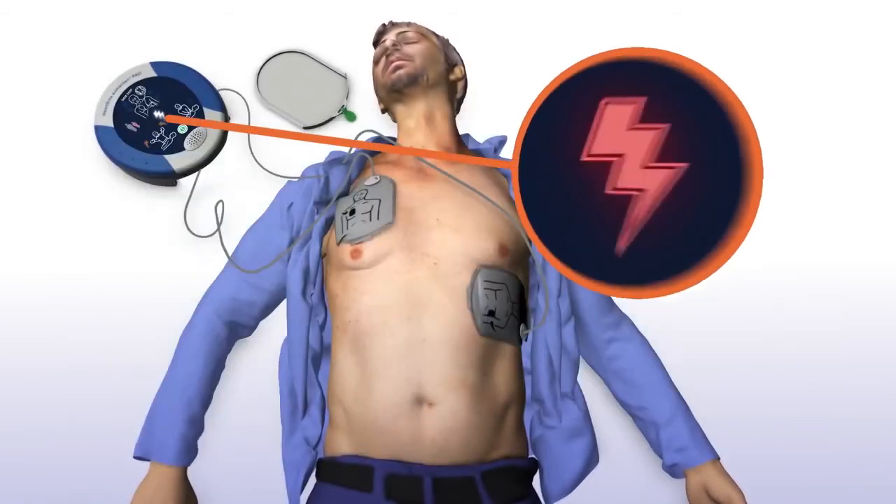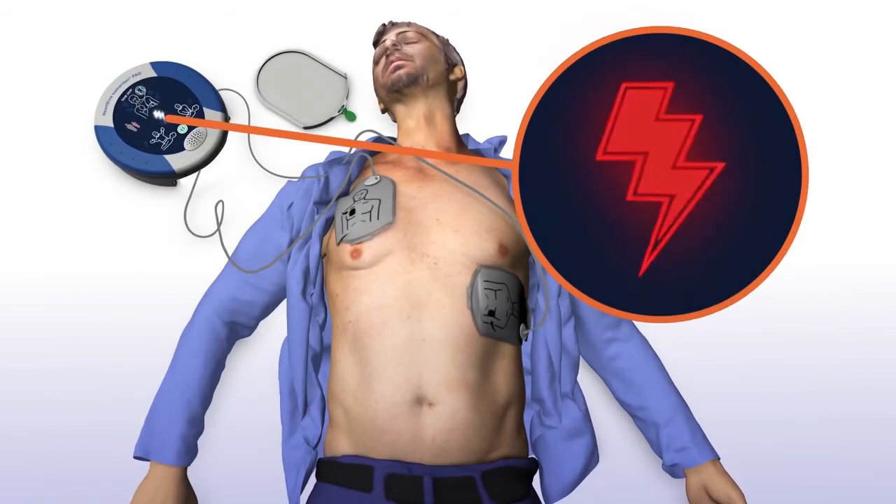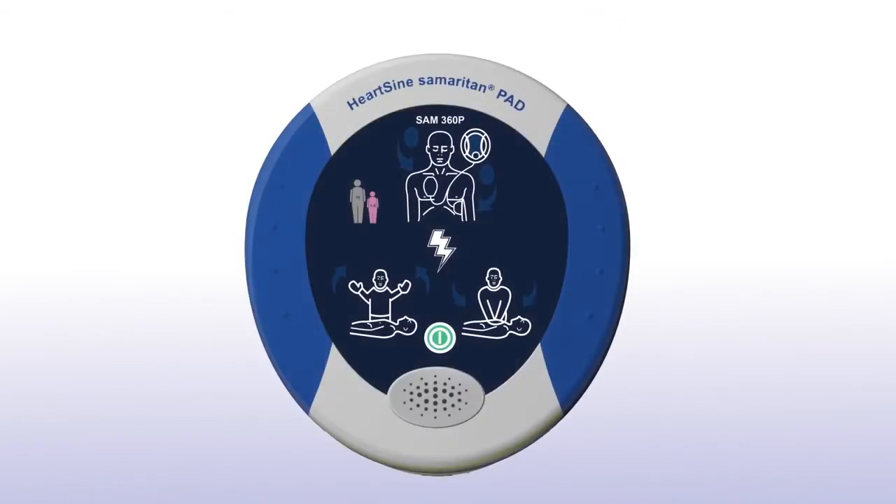The Samaritan PAD automatically assesses the patient's heart rhythm. Assessing heart rhythm — do not touch the patient. It will automatically deliver a shock if needed. Stand clear of patient. Shock advised. Stand clear of patient. Shock will be delivered in 3... 2... 1... Shock delivered.